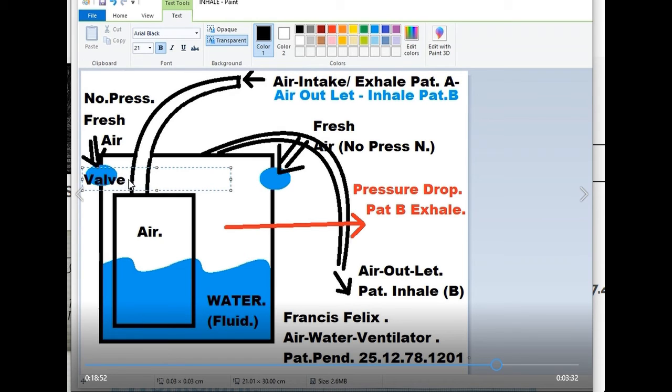And valve B, and these can be bidirectional valves, but I'm actually not so good at valves. There are things that I simply don't know, but some technicians can work them out, or at least this can be directed by an Arduino or some electronic unit that can manage this.